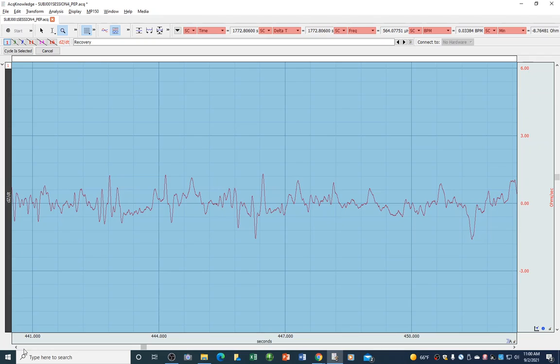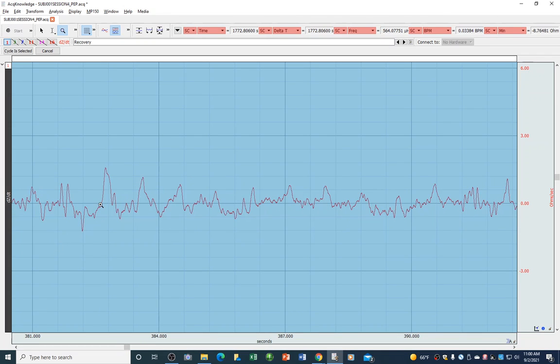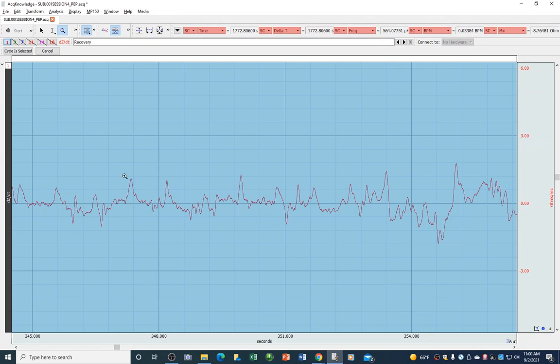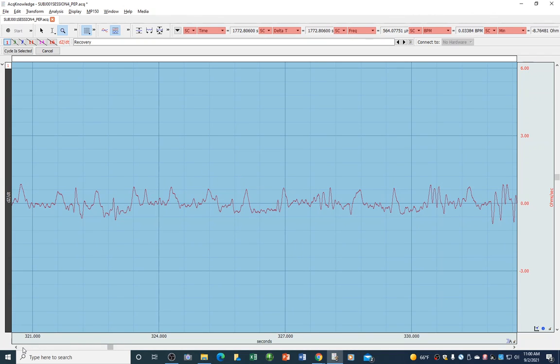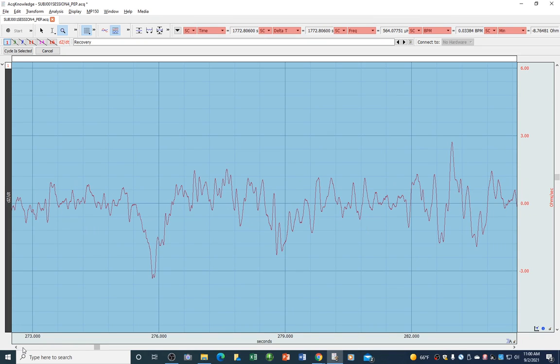It's a total mess of a signal. You can't get anything out of this. There's a few maybe, but I might declare this whole file 100% worthless. You're going to spend more time trying to clean it and salvage about 3 PEP values out of 30 minutes than it's all worth your time.